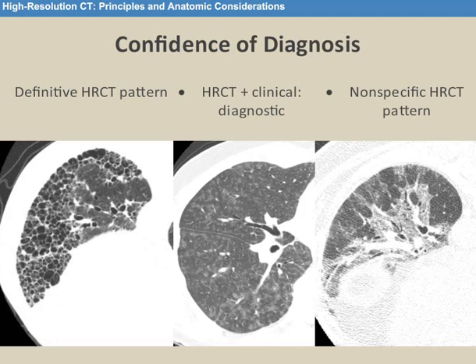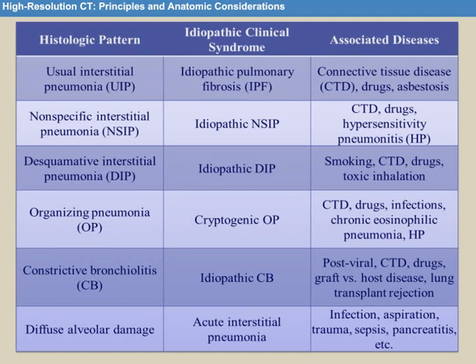And so you should decide which one of these categories each of the cases you see clinically is going to be in. And it's very important for everyone to understand the relationships of the pathology and the radiology and the diseases the patient has.